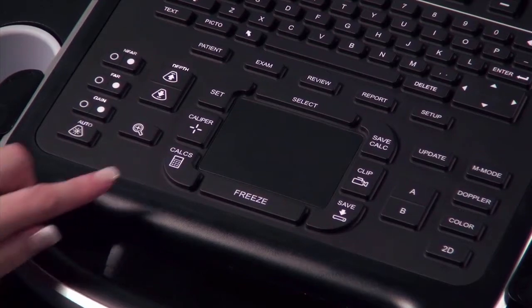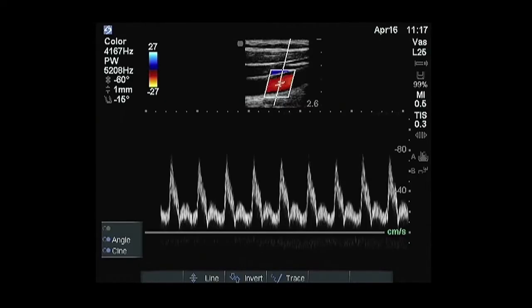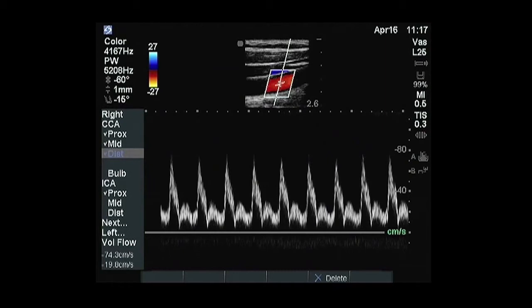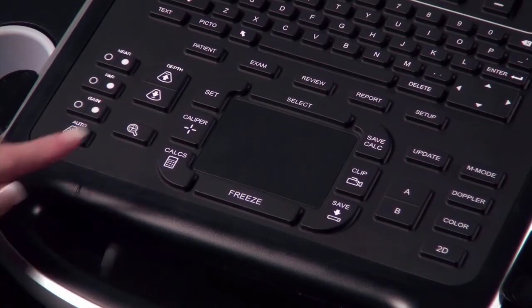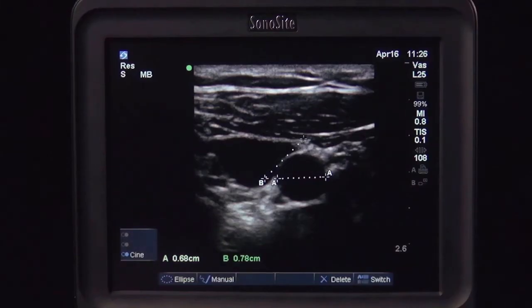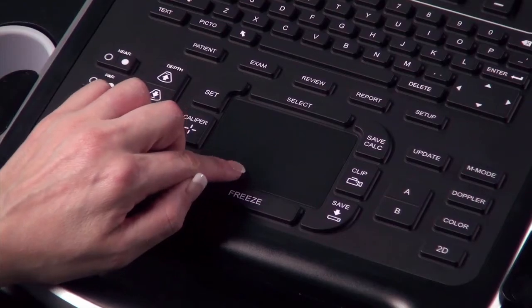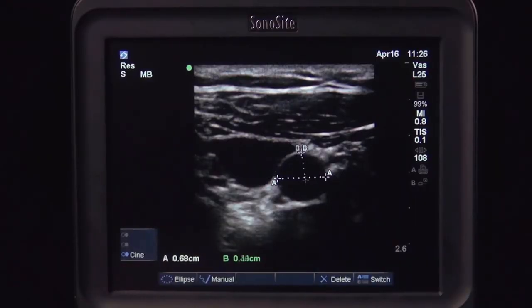The calcs key turns the calculation menu on and off. The menu displayed is determined by the transducer selection and exam type that is chosen. The generic caliper button activates up to eight sets of calipers on the screen. From this menu, area measurements may also be selected.